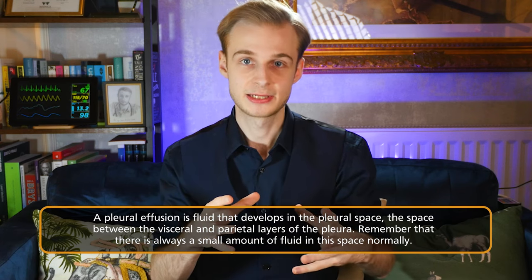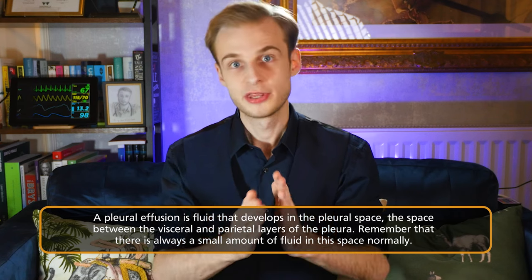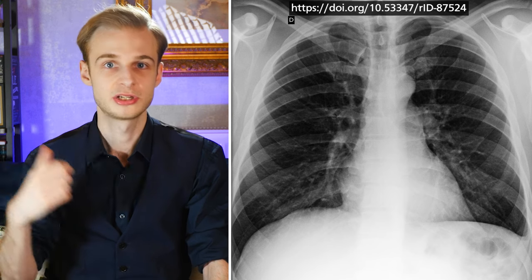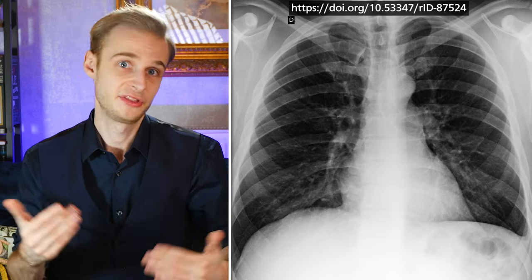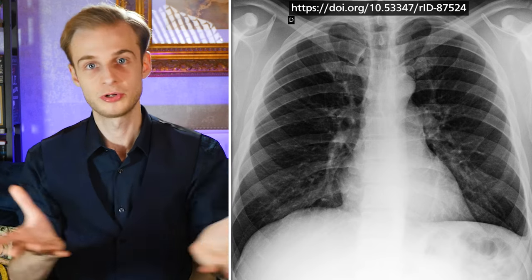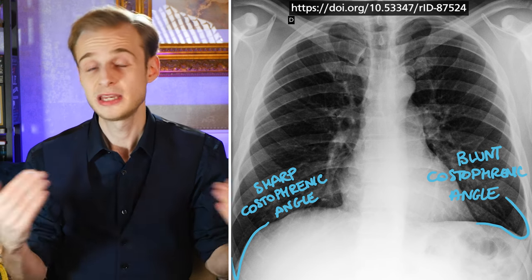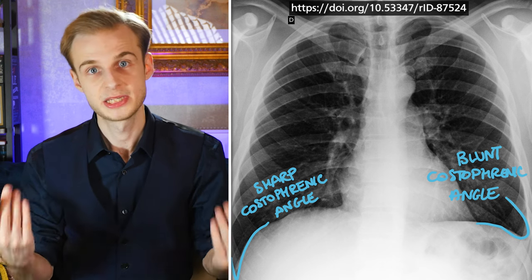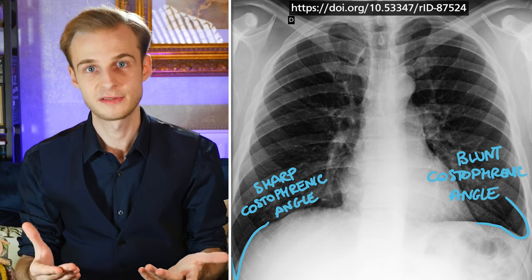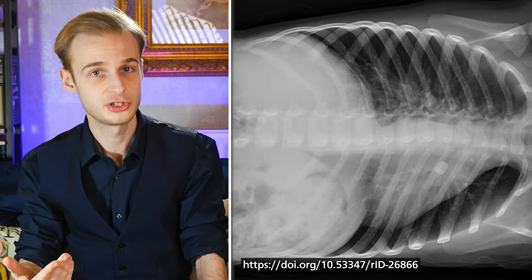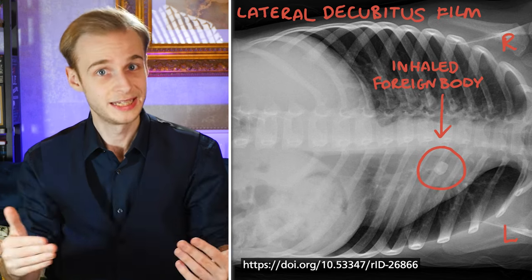Next up is a pleural effusion — a general term that describes fluid in the pleural space, the potential space between the visceral and parietal layers of the pleura. Do remember that there is normally a small amount of fluid in this space to lubricate the layers. There are many causes of pleural effusion including infection and mesothelioma. Normally we're looking for fluid around the diaphragm, as gravity will cause fluid to collect in the lowest point of the thorax. In practice this means blunting of both the costophrenic and cardiophrenic angles, and there may even be visible fluid in the lung fissures. If an effusion is especially large, there may be mediastinal shift as fluid pushes other structures away. For further investigation, you may want to request a lateral decubitus film to more clearly show where the fluid is.